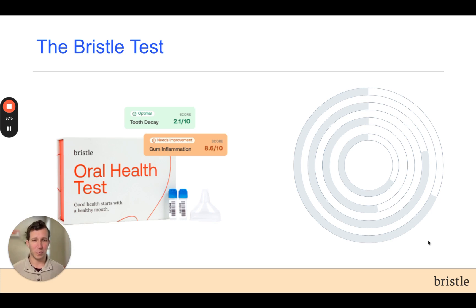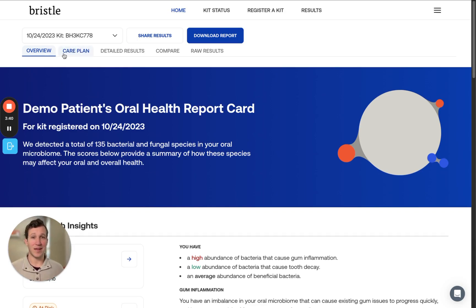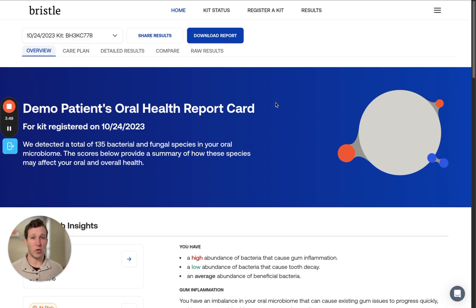Now we'll jump into the Bristle report to learn more. We're now inside your Bristle report. In the report, you'll find that there are five tabs that contain different information for your test results. The primary tab is your overview tab, which contains your oral health report card, and we'll explore that in more depth shortly.